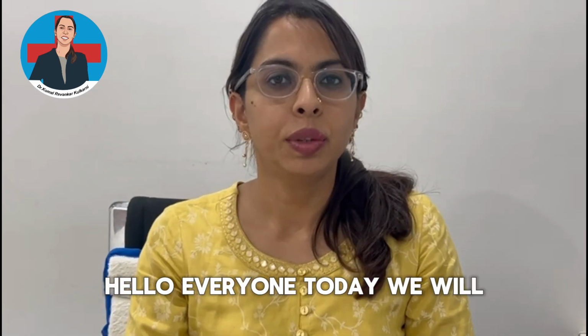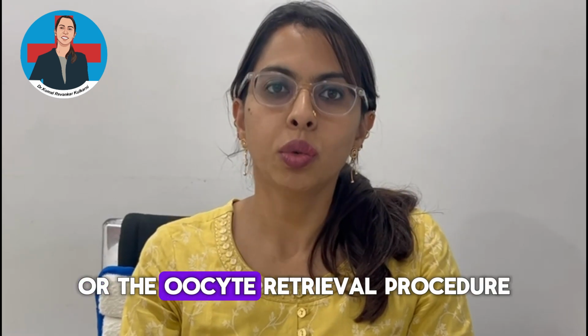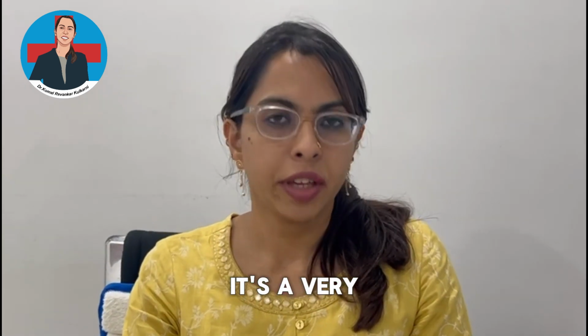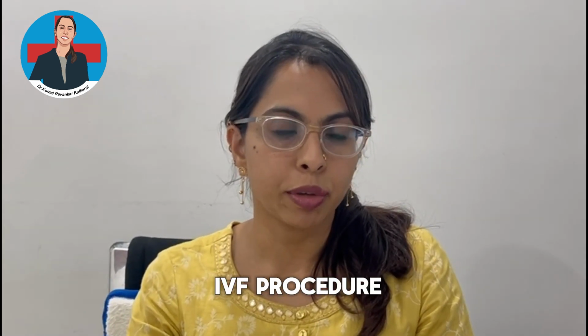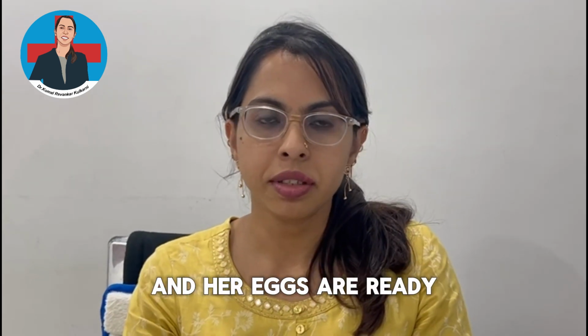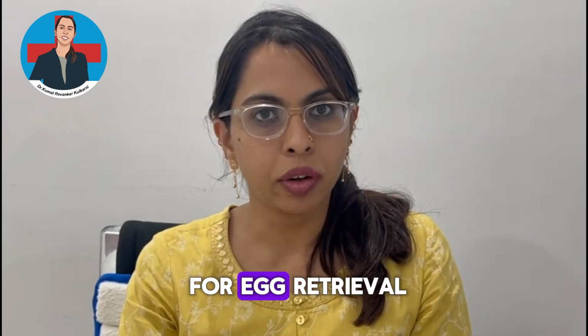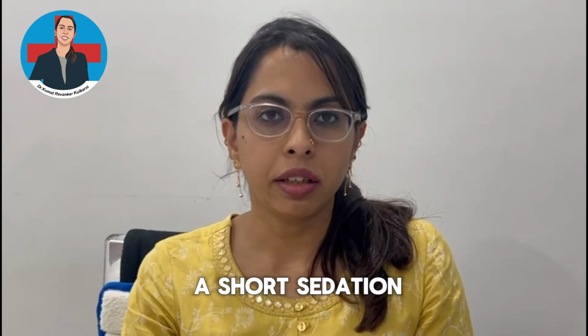Hello everyone. Today we will see what is egg pickup procedure or the oocyte retrieval procedure. It's a very important step in an IVF procedure. After the woman is stimulated with injections and her eggs are ready, she is prepared for egg retrieval, which is done under a short sedation.